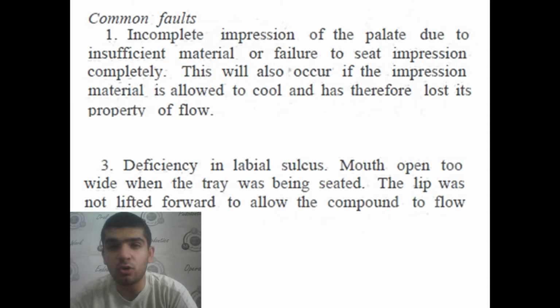So we have three causes for incomplete impression of the palate. Either the material cooled down and it no longer has the flow property, or insufficient material, or we didn't seat the impression completely into its position.